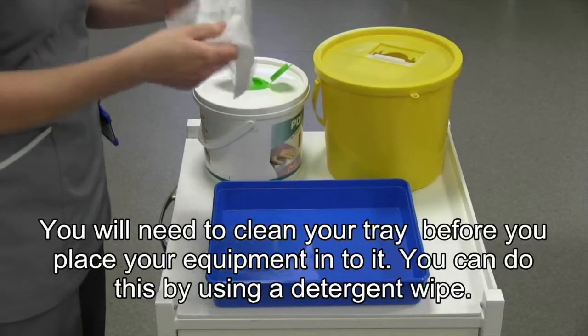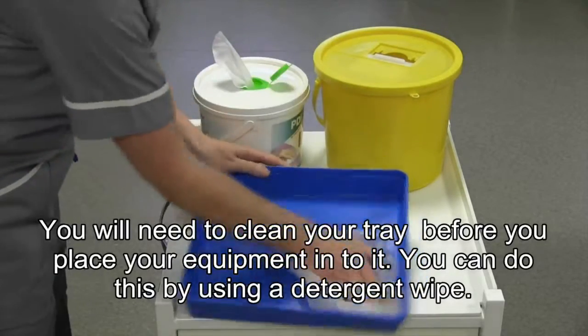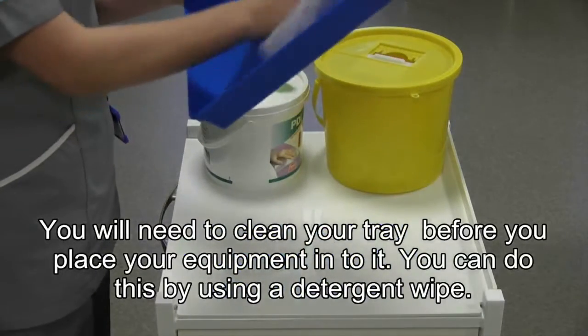You will need to clean your tray before you place your equipment into it. You can do this by using a detergent wipe.